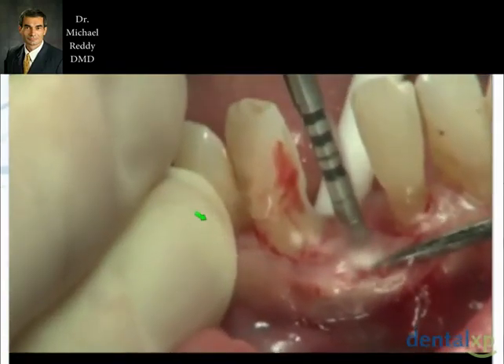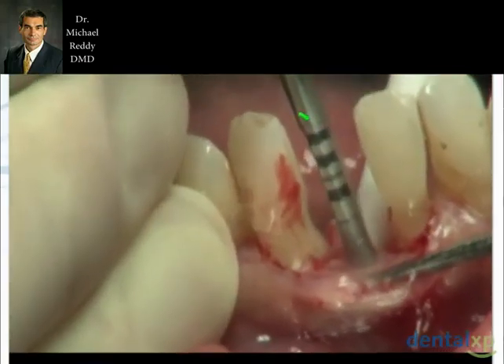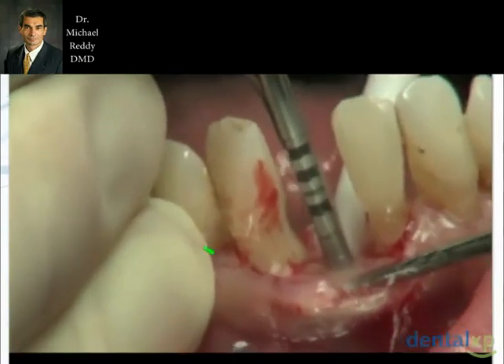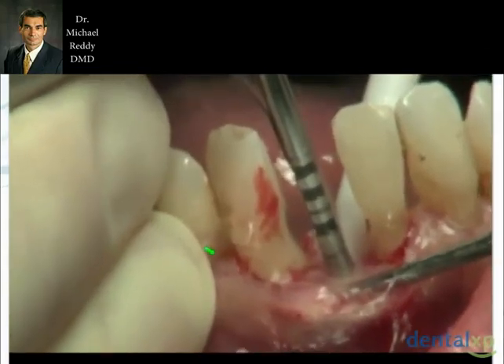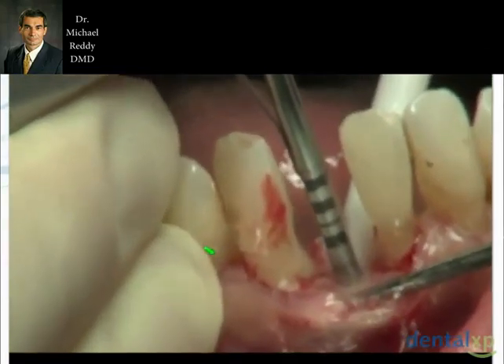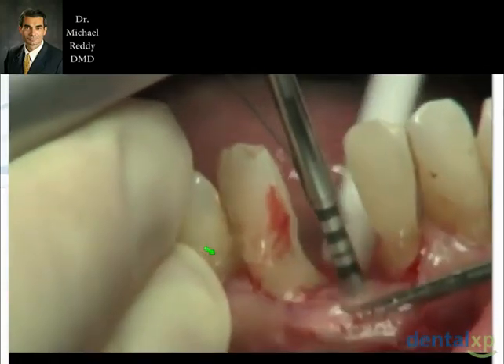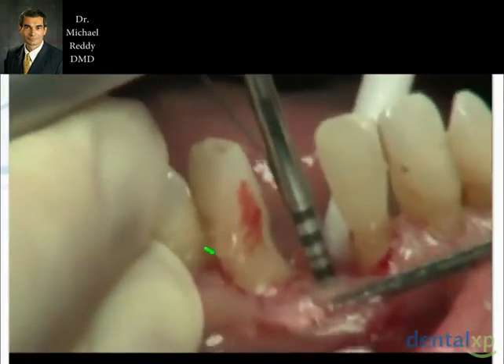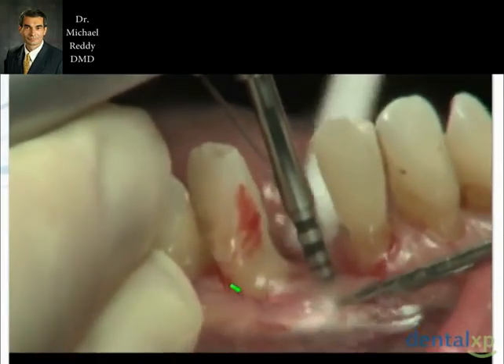Now the reason why I like the long shank drills here is you can see how easily it fits in between the adjacent teeth, and you have lots of room in the anterior, and you can use this to check for the angulation and make sure that we're placing that implant in a parallel fashion. So this is now the 2 millimeter starter drill coming up on 12 millimeter length at this point.